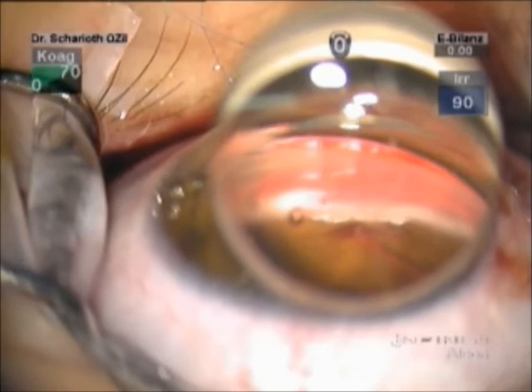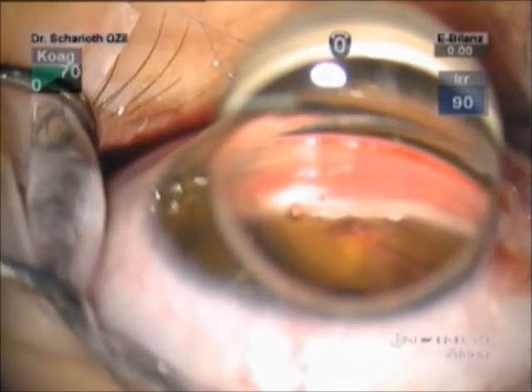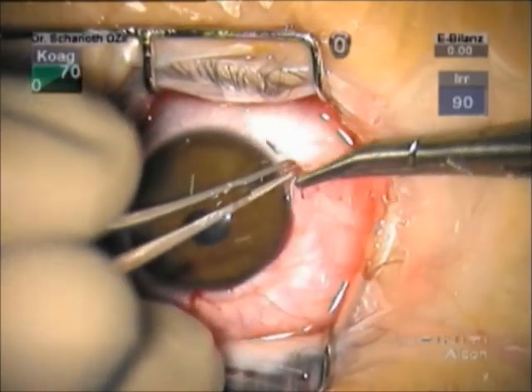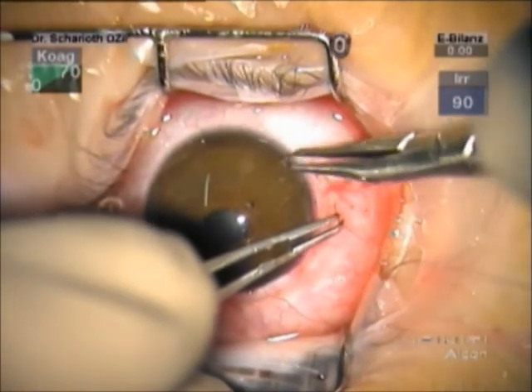After successful repair of the cyclodialysis cleft, IOP in this case returned to normal values. The pupil, thanks to the intraocular approach, was only minimally distorted towards the sutures.